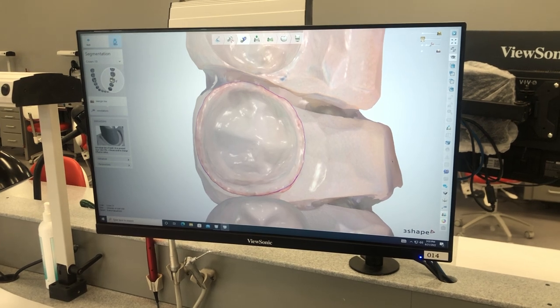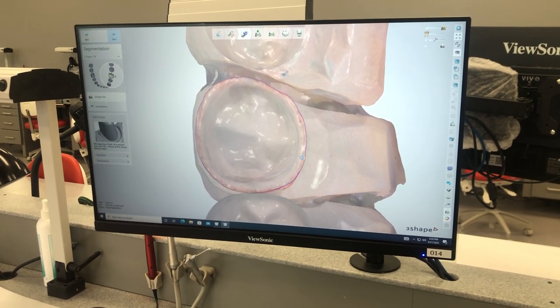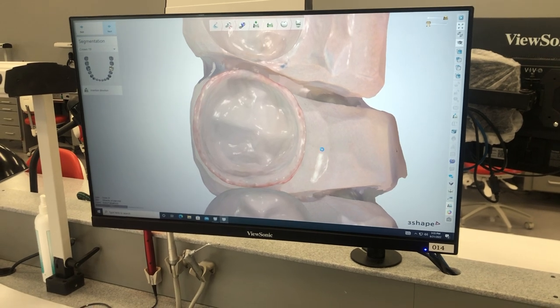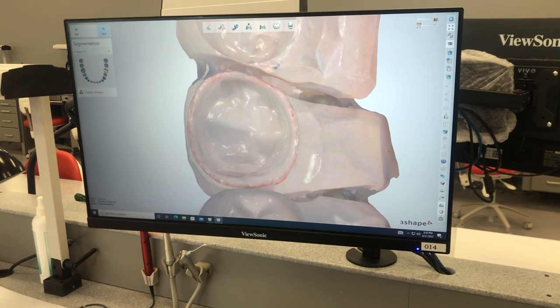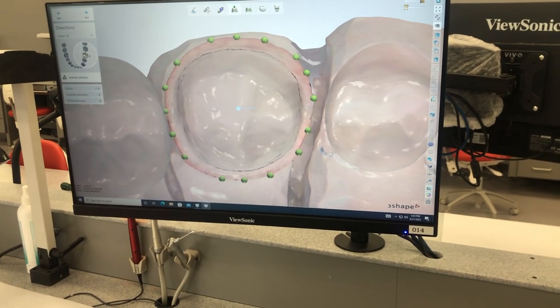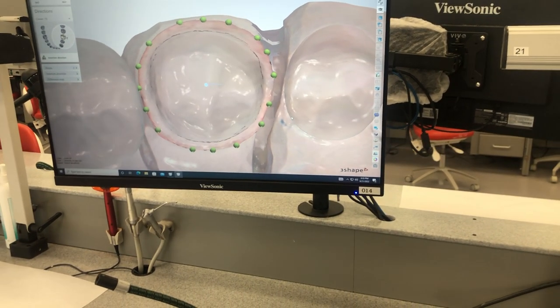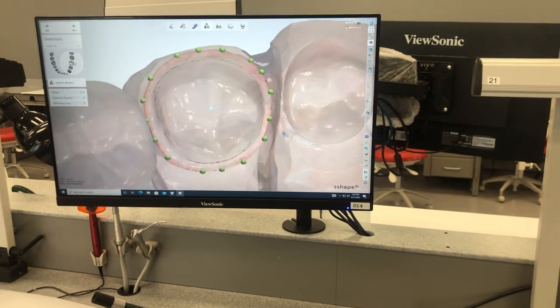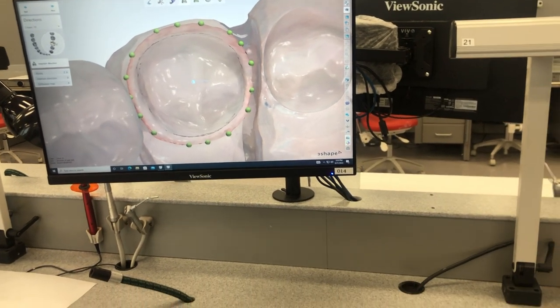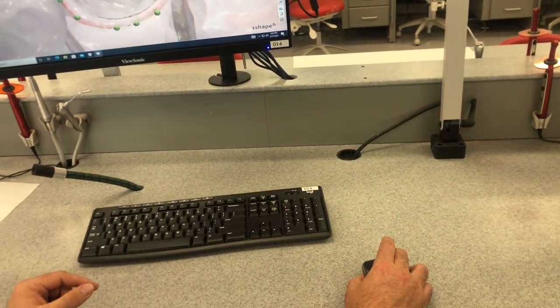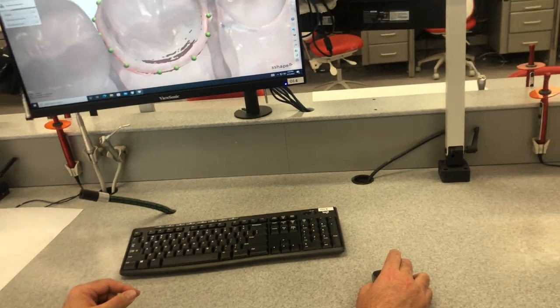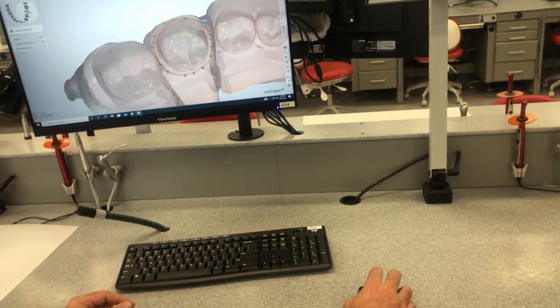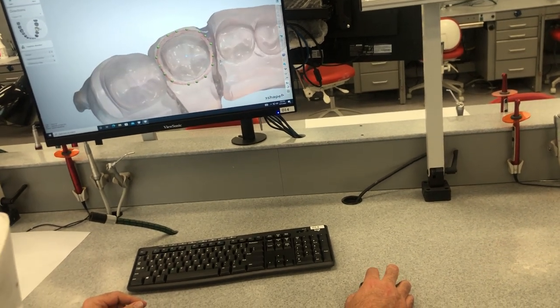The other thing that I'm going to show you is the controls on the mouse. They're a little funny. This is your insertion axis, is telling you where you potentially might have undercuts. It looks good. We've set this in the other software, but on your right click, if you right click and hold, it'll rotate things.